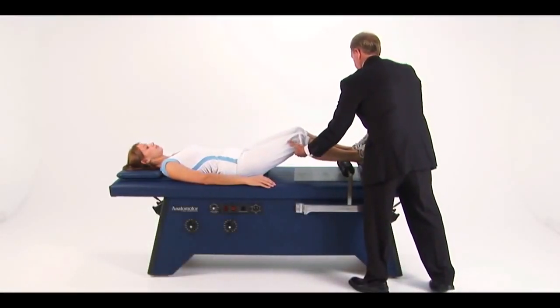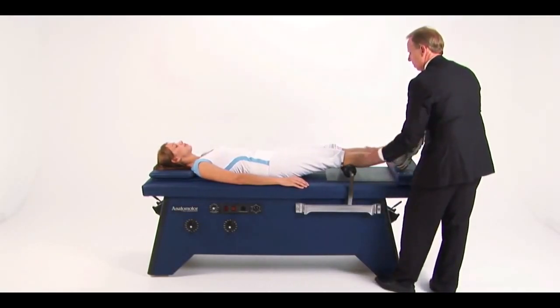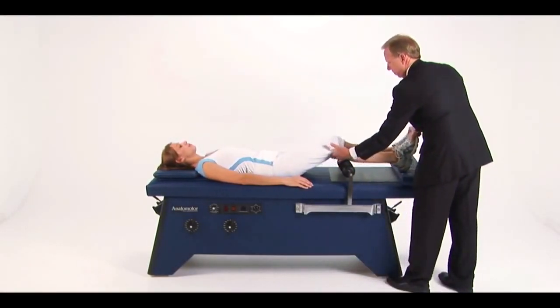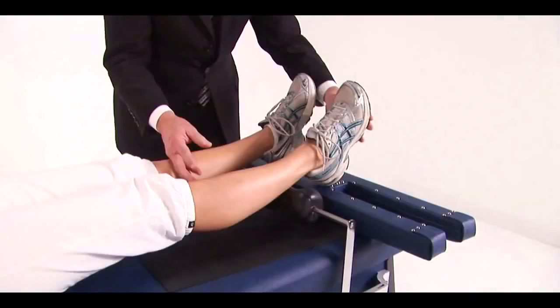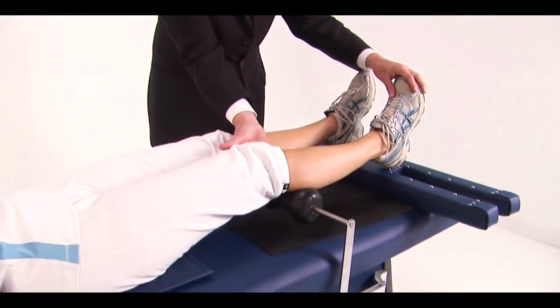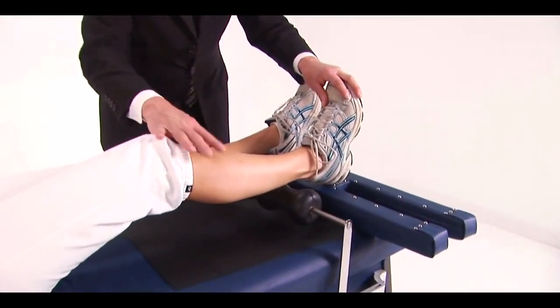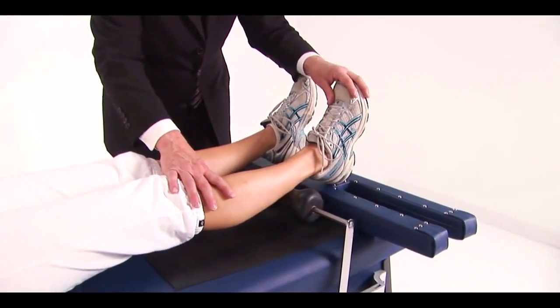For mild cases of edema, leg rollers may be used to encourage venous drainage. Rest the patient's legs on the rollers as the table glides to the foot end or lumbar position. Then raise the patient's knees as the table returns to the head end. This will push blood and lymph away from the ankles. Patients can easily learn to do this unassisted.